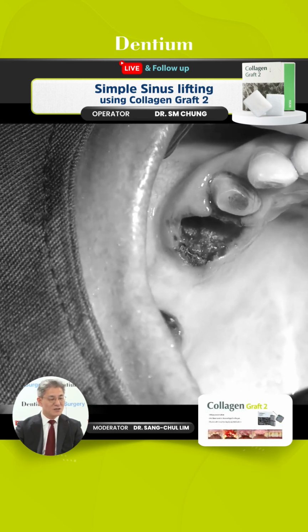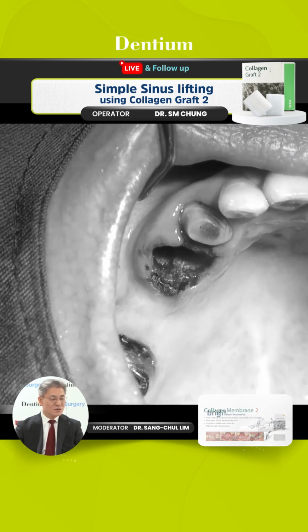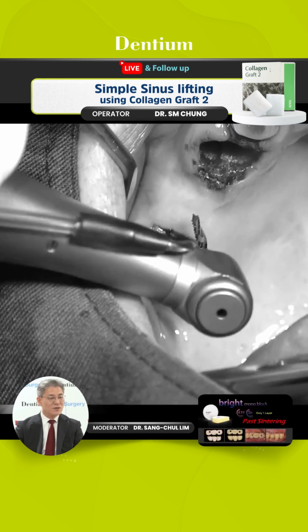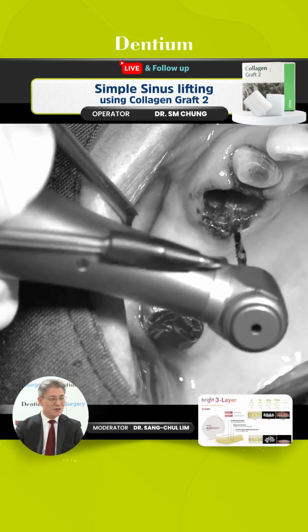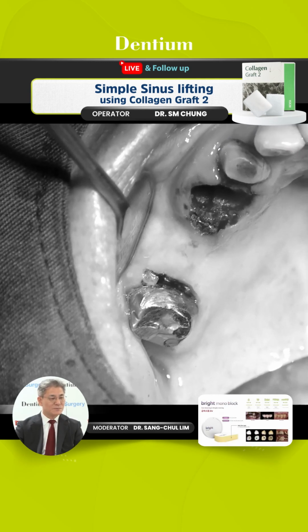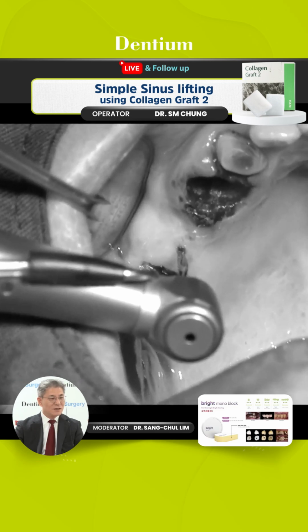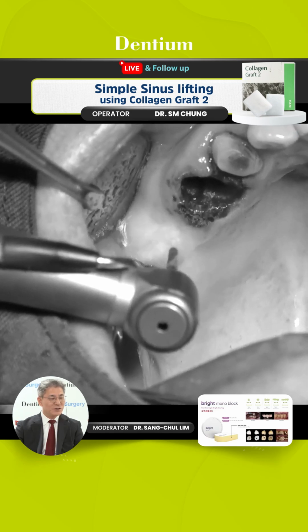That is the proper concentration to use for detoxification, and also sometimes this TC with the saline is applied to the surface of the wall for decontamination, detoxification, sometimes exposure of the fiber. However, now this TC tetracycline mixture is applied into the socket for this detoxification.